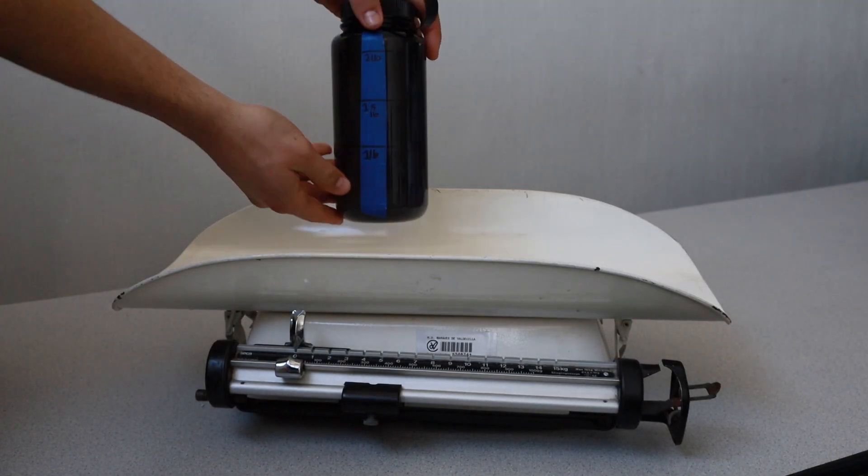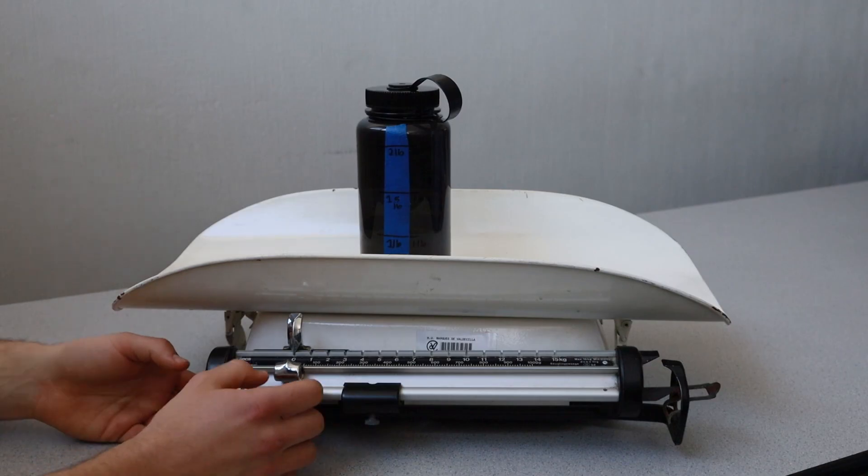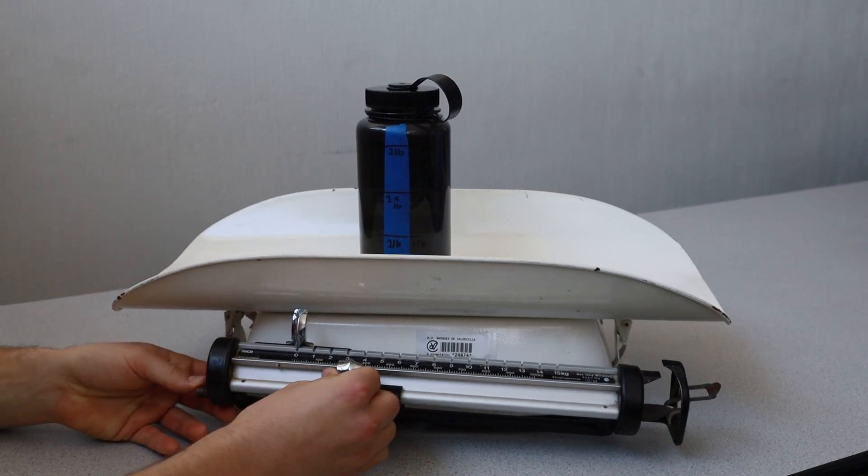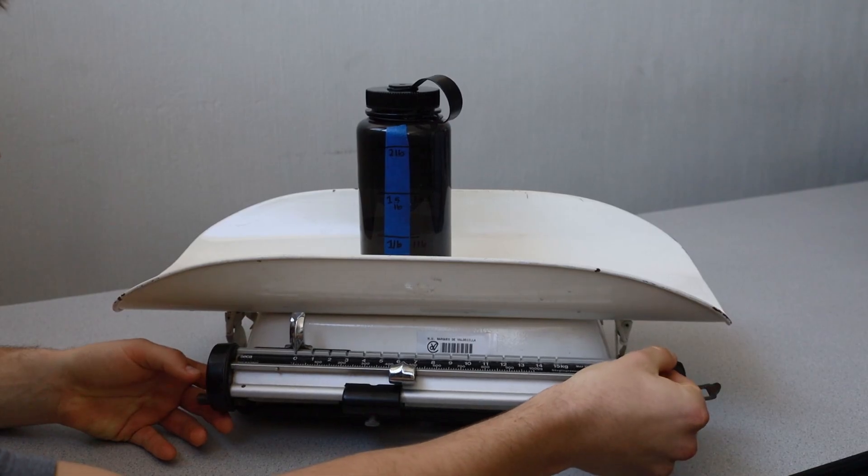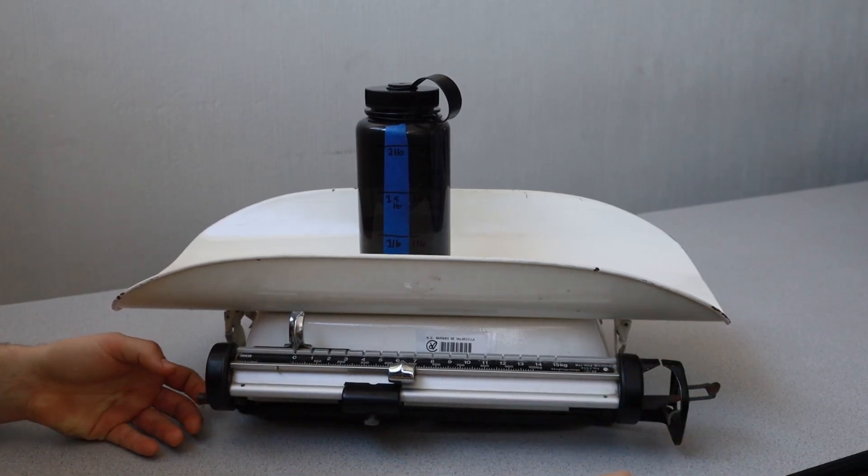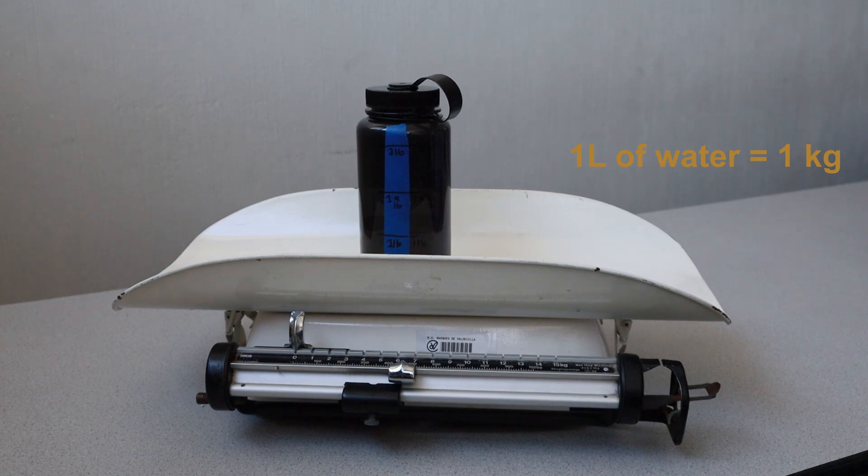To double check that the scale is calibrated, a known mass can be placed in the weighing basket and weighed using the previously described procedure. A bottle of room temperature water can be used as a known weight if no known weights are available. If available, fill a small container of water with 3 or 4 liters and place it on the infant scale. 3 liters of water should weigh approximately 3 kilograms. 4 liters of water should weigh 4 kilograms.